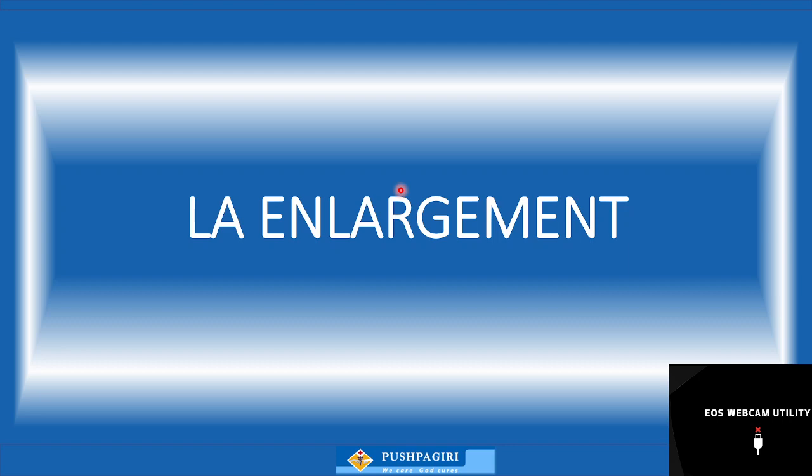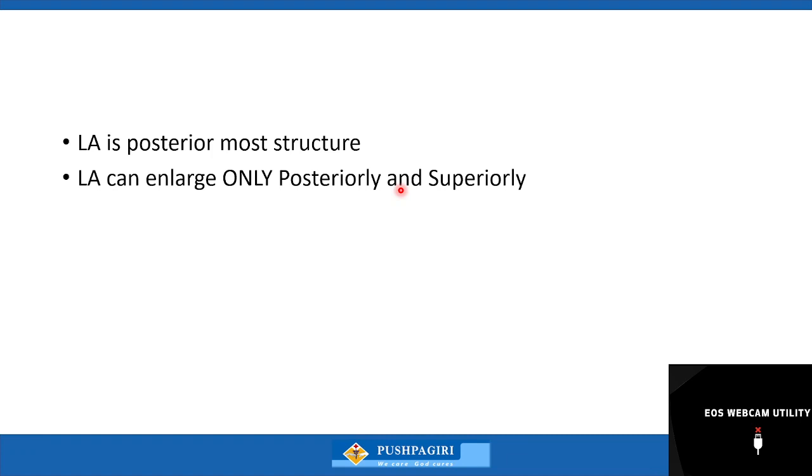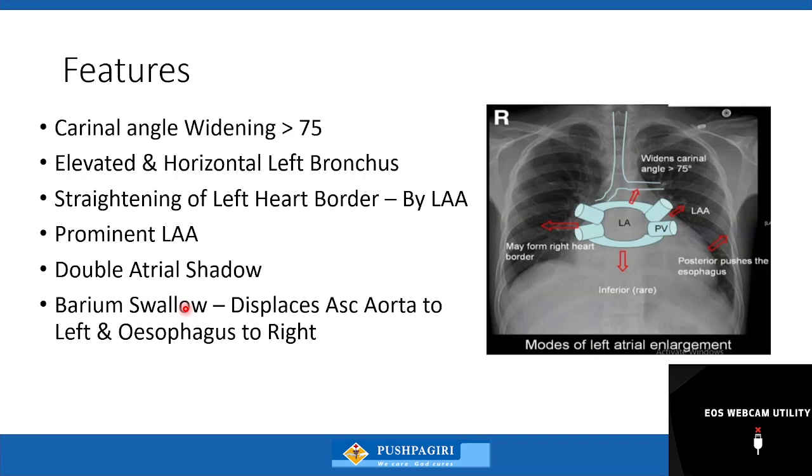Then coming to LA enlargement. We have seen that LA is the posterior-most structure, and the LA can enlarge only posteriorly and superiorly. So it can enlarge in this direction. LA will enlarge in this direction.